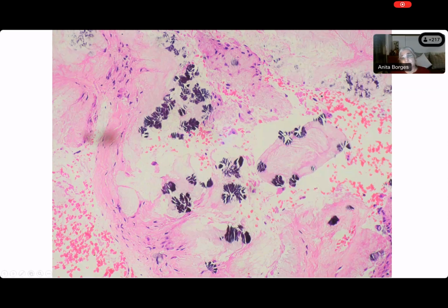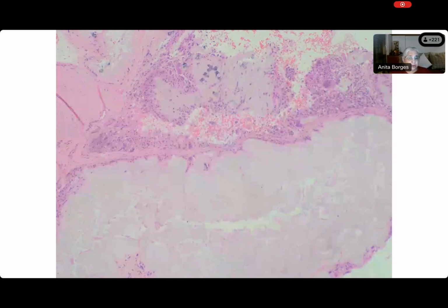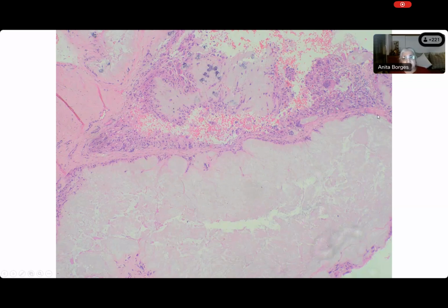The calcification is not star-shaped, Mansi. Prayas is telling you something, that there are crystals. Yes, they look like crystals, right? So there are needle-like crystals which have all come together to form a kind of star shape. Okay, so if you go back and look at what you're seeing over here, you have some cellular component that is surrounding these large areas of acellular material, and there is a word for this. That's why I want you to understand this word.